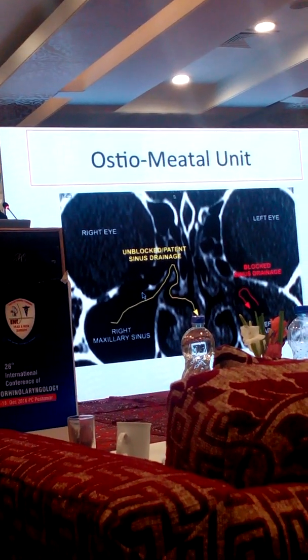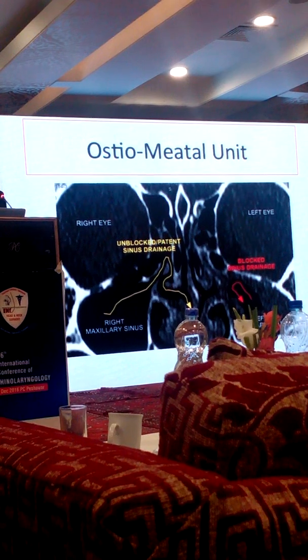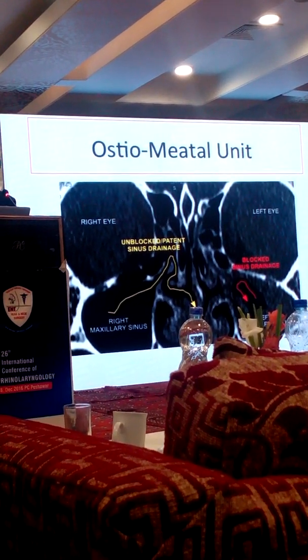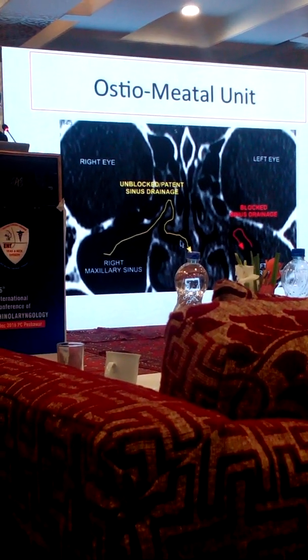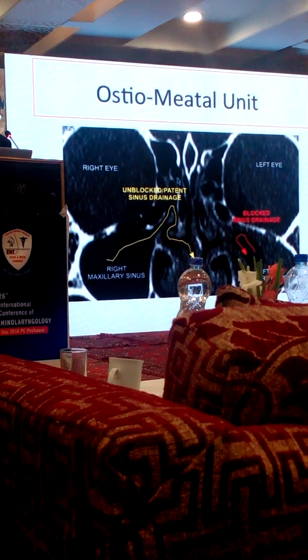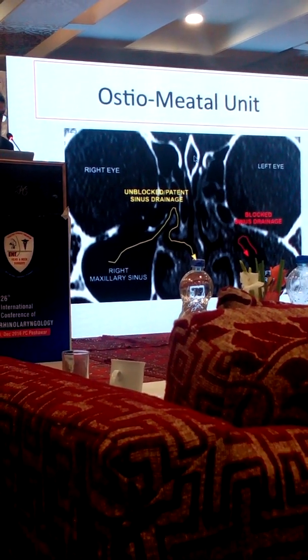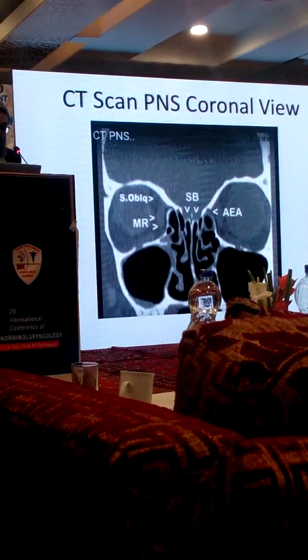We have to classify in a sinusitis whether it is an ostiomeatal complex disease or a sphenoethmoidal recess disease. So we will see whether there is any blockage in the nose. It is very clear on this side and it is obstructed on this side. Okay, incidentally there is a pneumatization of the crista galli in this as well. The orbits are okay. Okay.